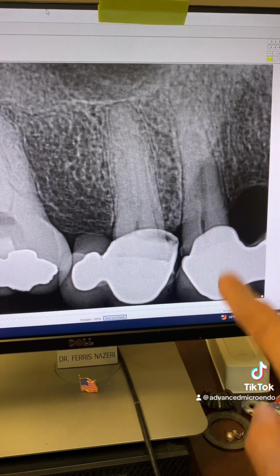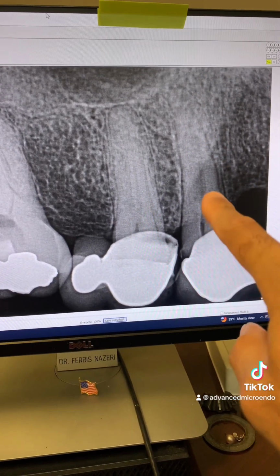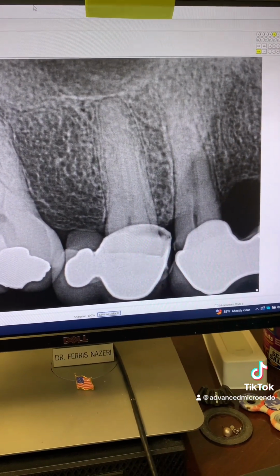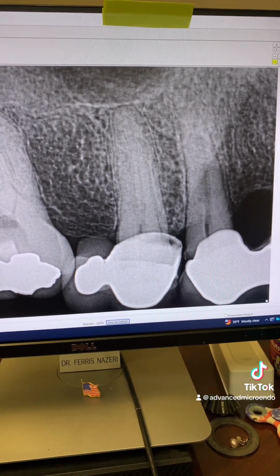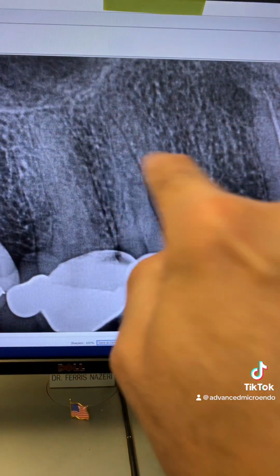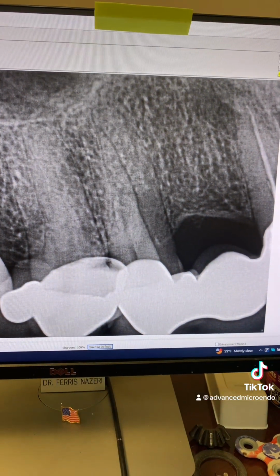But do I need a CBCT for this tooth? It looks like you can see the canal and then it disappears. That's usually a sign of the tooth having two canals or two roots. So take a look. Just one more PA, and there you go. And now you can see two roots. That's one, and that's the other one. So I don't need a CBCT.